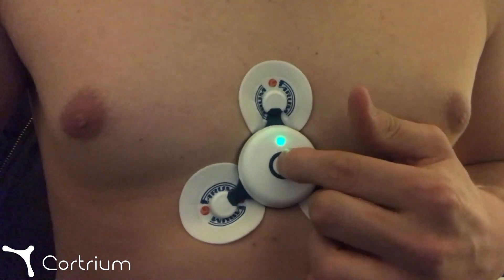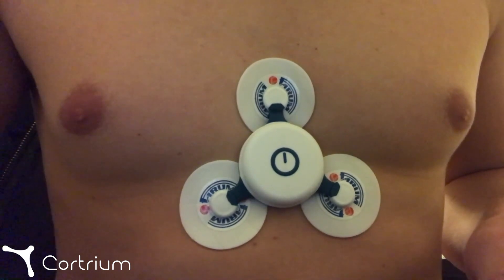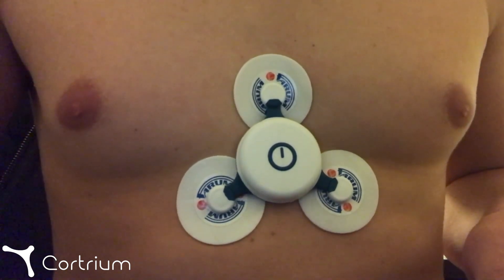Now simply press the button to start the recording. The green light might start to flash fast in the beginning, but will turn to a constant slow pattern after some seconds, indicating that the device is now recording.